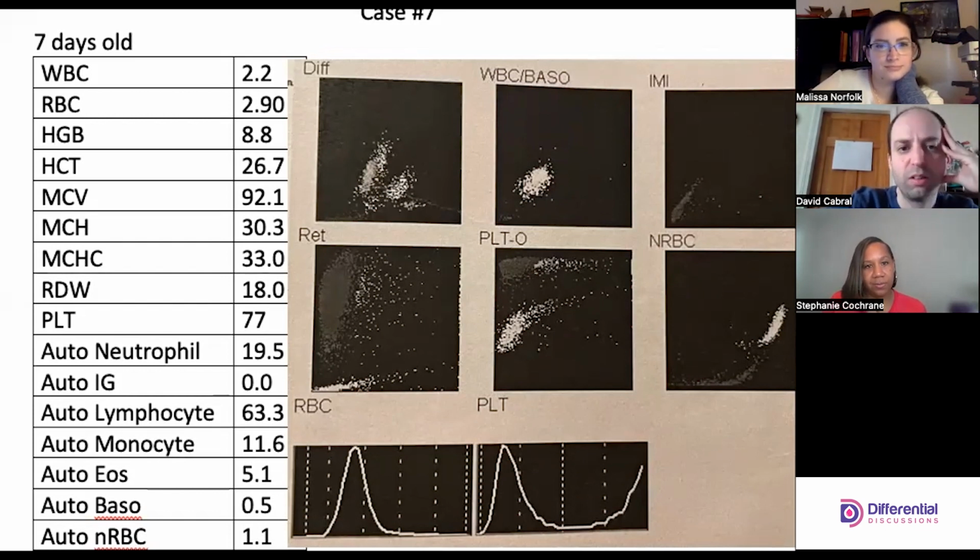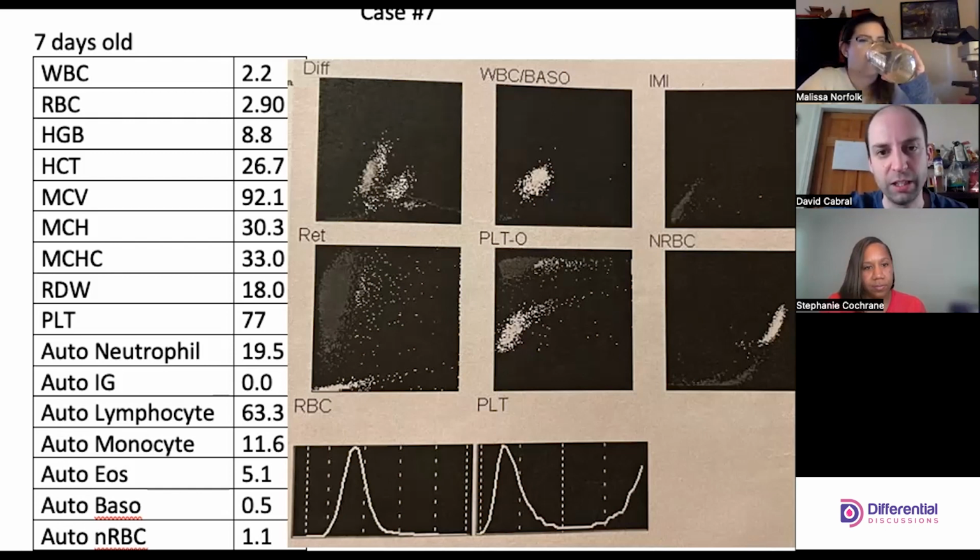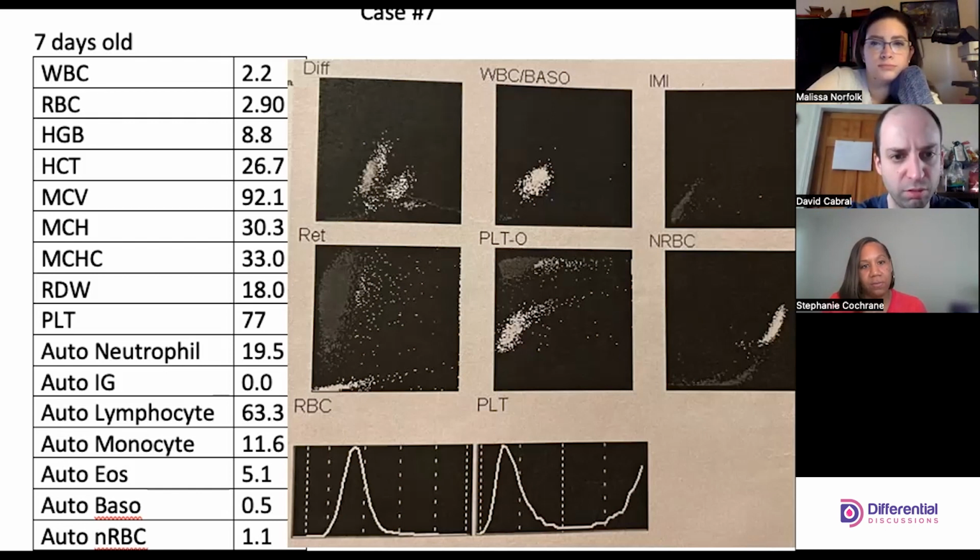Yeah, MCV is pretty normal. I would say MCHC too, so normocytic normochromic RBCs we should see. Yeah, the RBC histogram looks really nice, actually. The RDW is a little bit high, but it looks nice and Gaussian. Diff scattergram. Looks like there's a lymphoid population. Yep. Some monos. Lymphocytes are a little elevated or more than elevated. Great. And then I think we have what looks like a neutropenia, just in general. So 2.2, 20%. So neutrophils are really, really low.